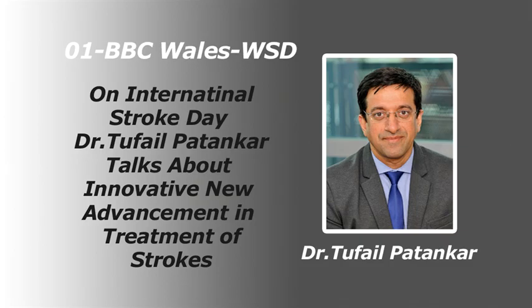Good morning. You've been using this new treatment for a little while, haven't you? Before it became widely available. Can you tell us how it works? The treatment is called a mechanical thrombectomy, and what we do is we use X-rays to pass a tube into a blood vessel which is blocked in the brain, and then we use that tube to carry the stent, and that stent opens and picks up the clot, and then you can use the stent to pull the clot out from a blocked vessel.